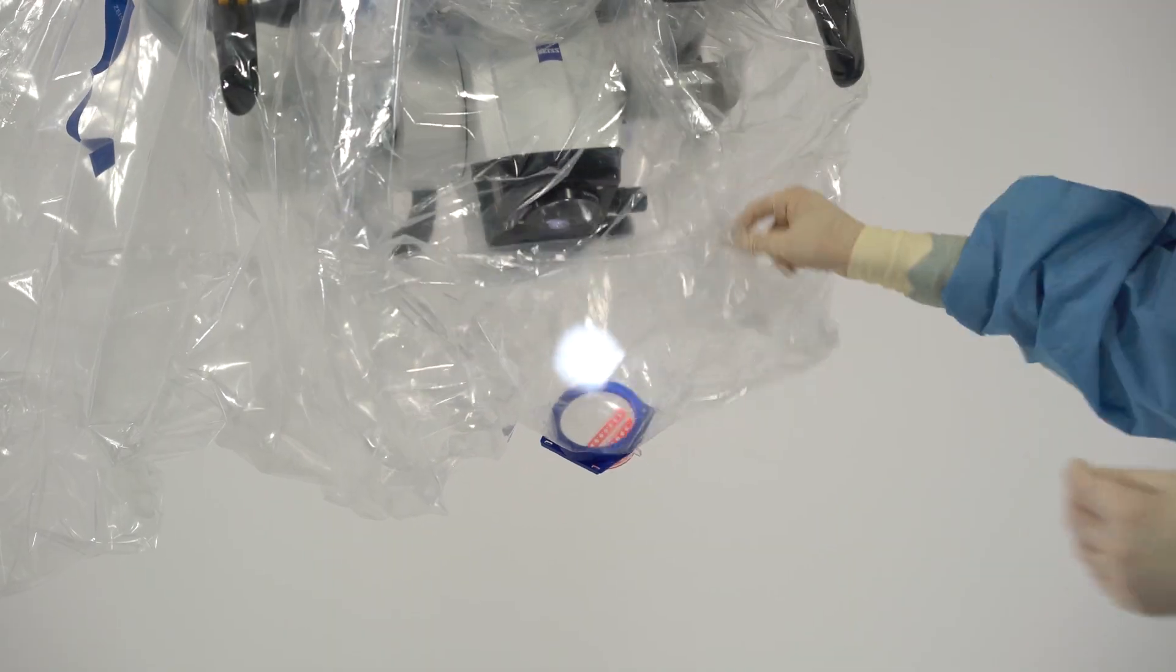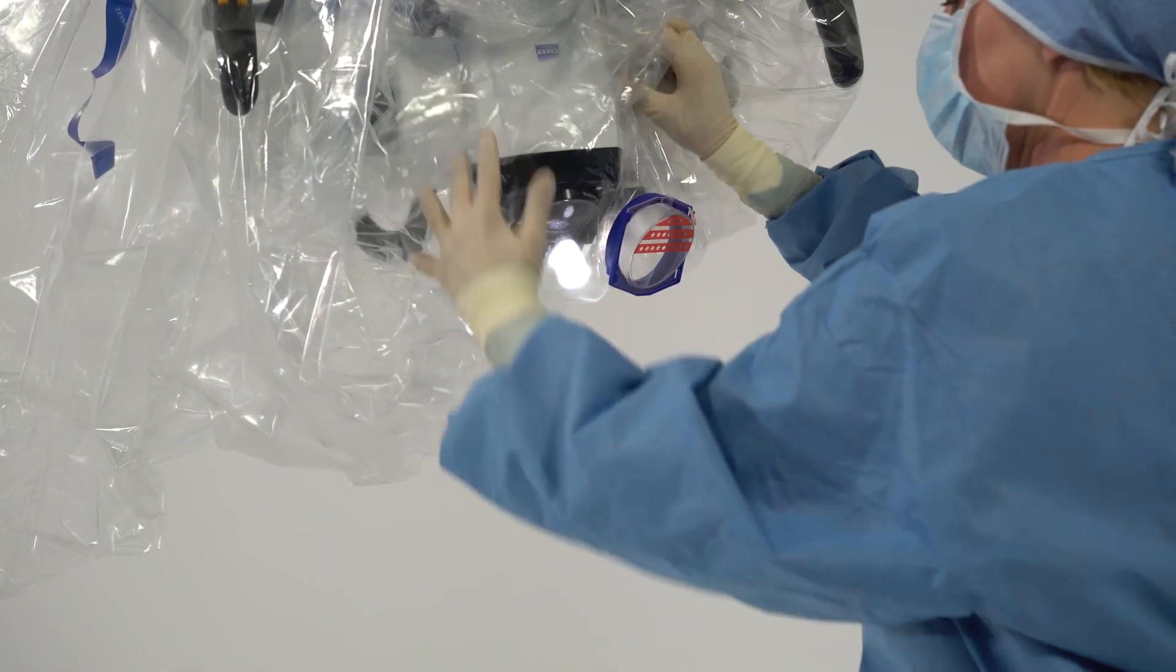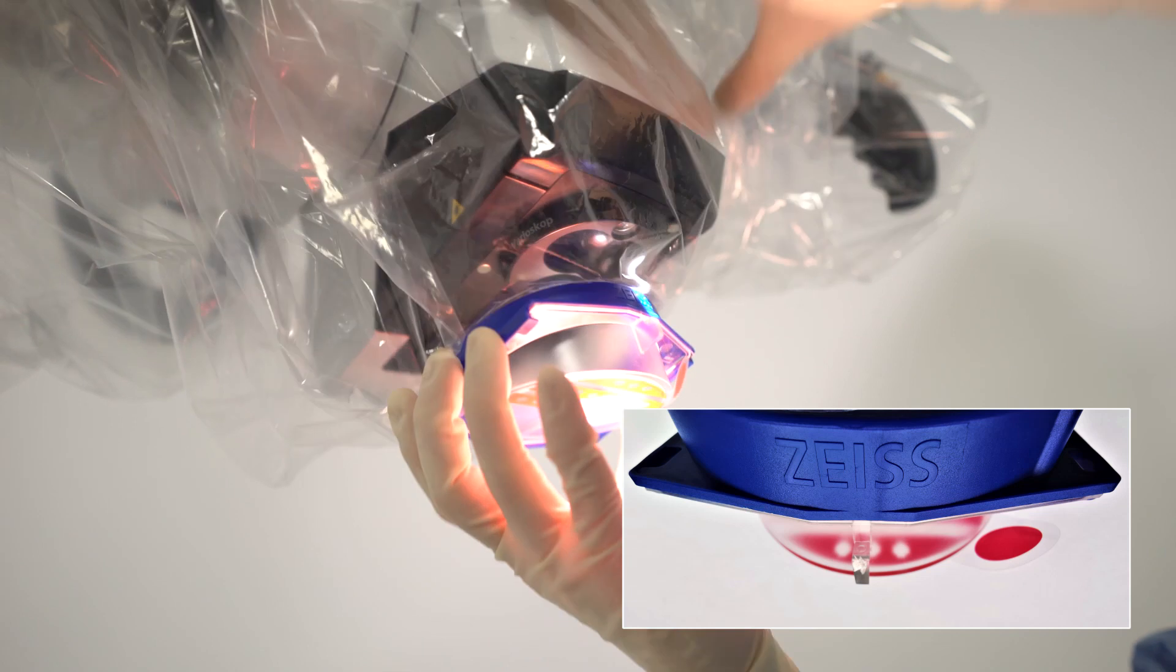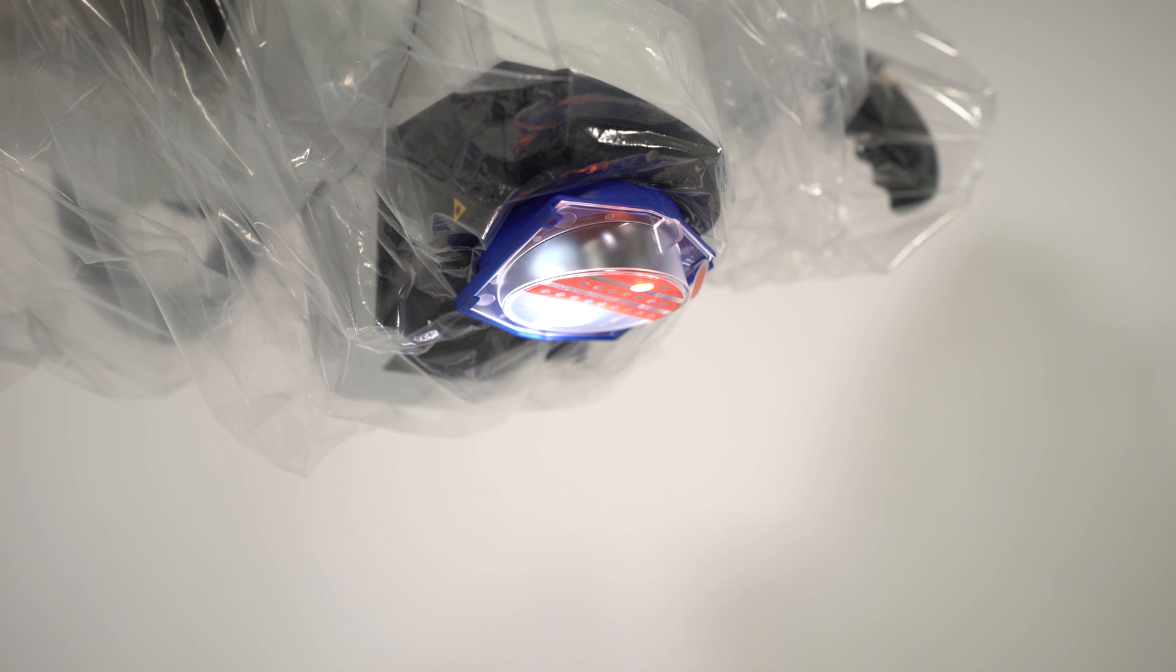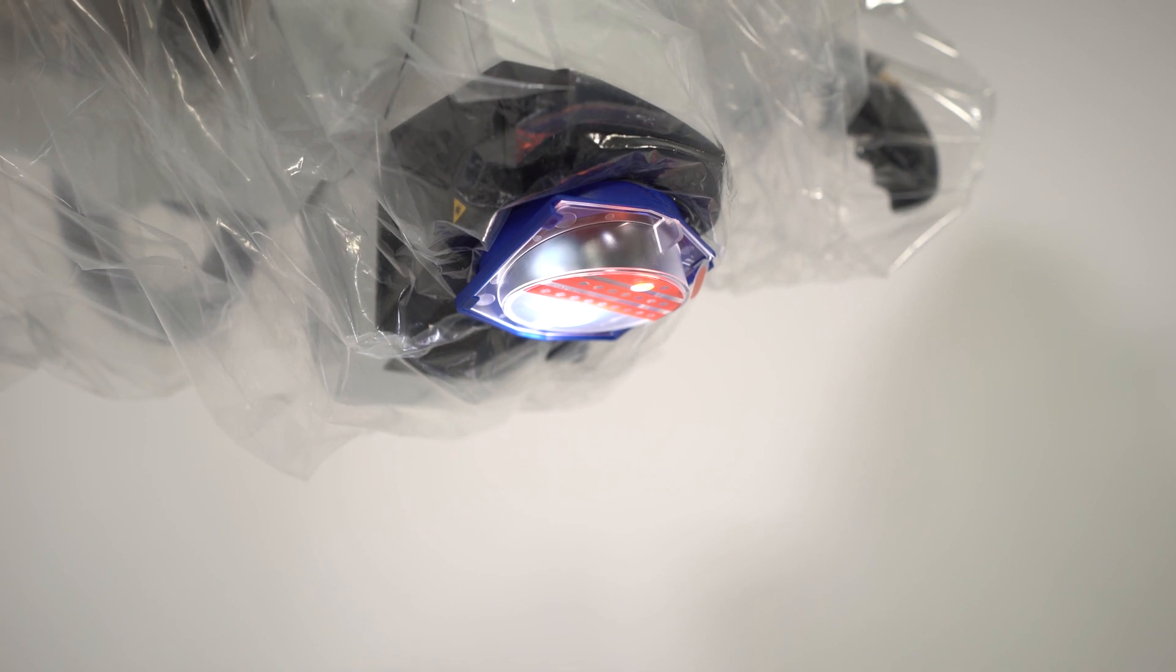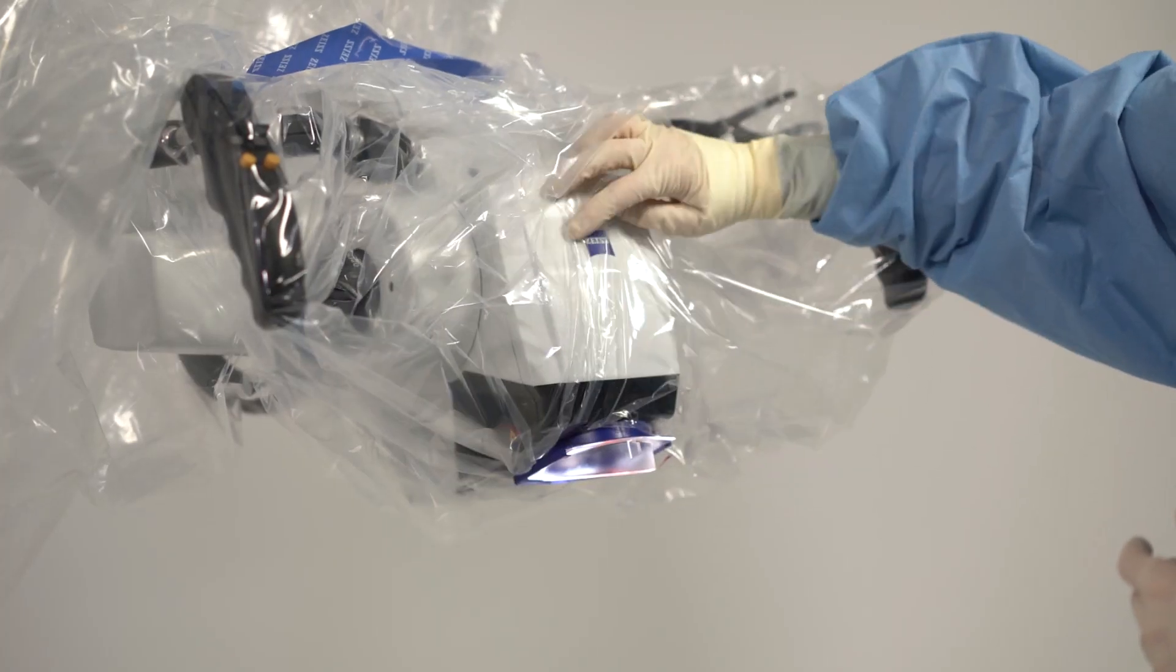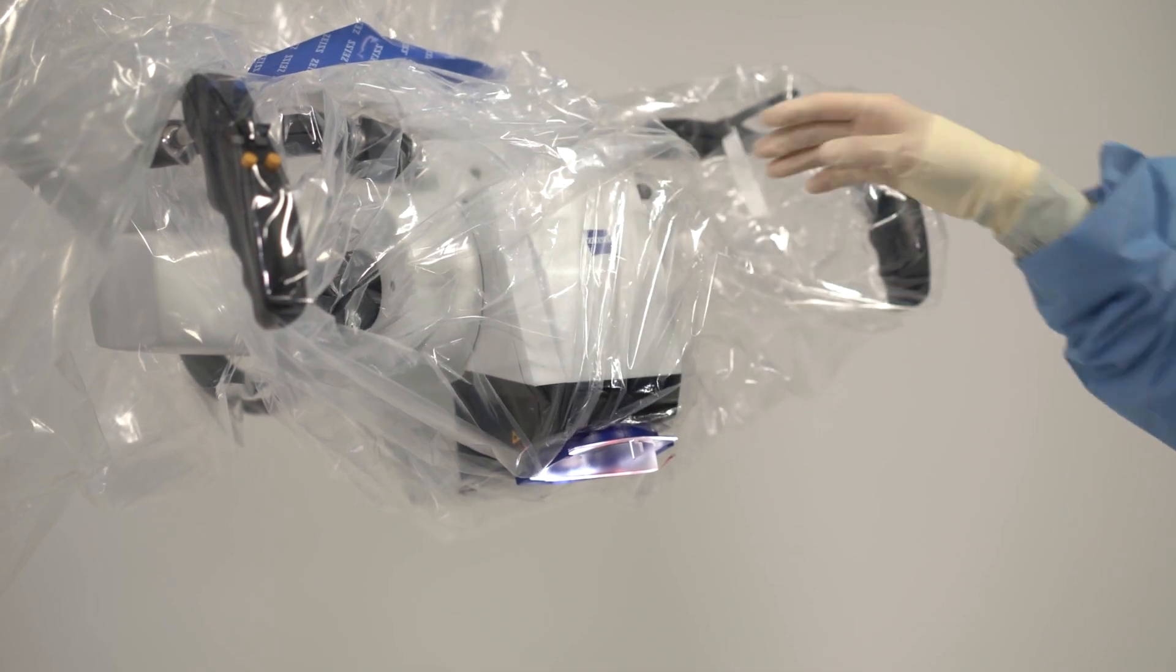Hold the Vision Guard lens of Zeiss Smart Drape such that the Zeiss Text faces you. Move Vision Guard under the lens. It will snap into the right position automatically with support of the Vision Guard magnets. Make sure there is no foil between the blue ring and the device.